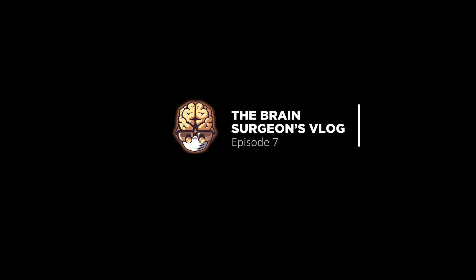Come and join me in the operating theatre as I take you through a craniotomy. This episode is geared towards the public and patients to learn more about what a craniotomy is and how we do it, but junior neurosurgeons can also use it because I'll be covering a couple of pearls and technical tips that'll really help you get through the first few times you use these tools.